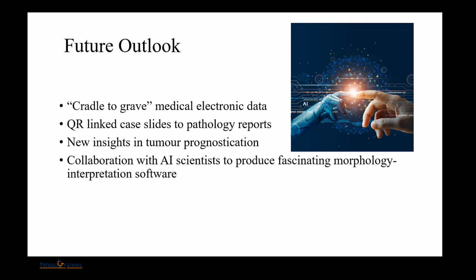Next, going on to the future outlook. Right now, all hospitals are moving towards becoming paperless hospitals. So it's possible to get this new concept, which is cradle-to-grave electronic medical data of the patient. Each patient's entire medical data, right from birth to death, will be stored in an electronic system. Next, we could have pathology reports with QR codes in them. The patient can just scan those QR codes and view their slides even if they move to a different state or different country, or even after 10 years they have access to their own slides.